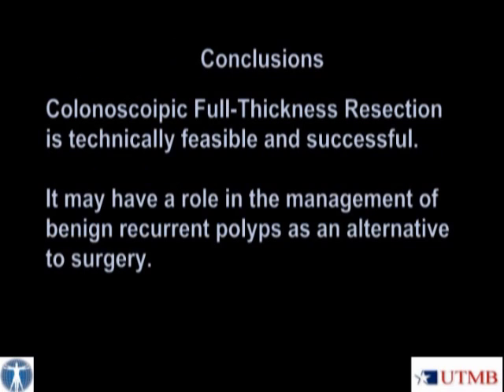In conclusion, colonoscopic full thickness resection is technically feasible and successful. It may have a role in the management of benign recurrent polyps as an alternative to surgery.